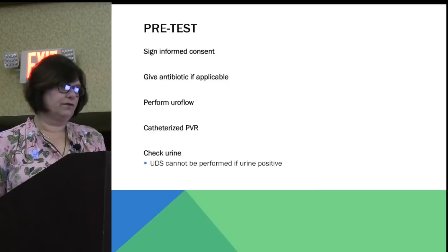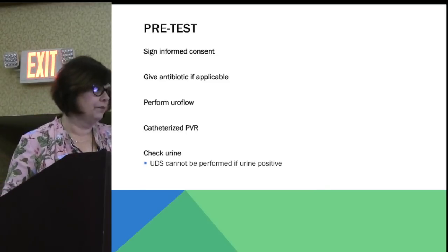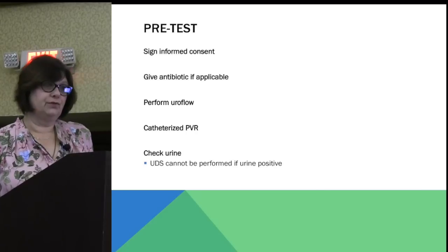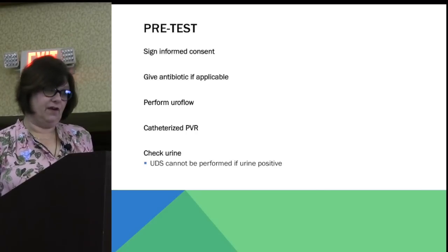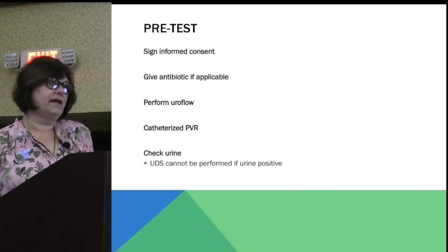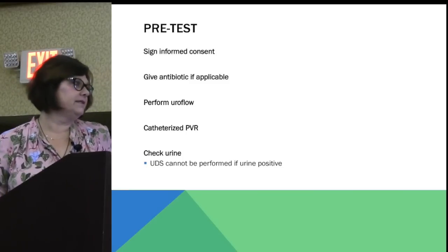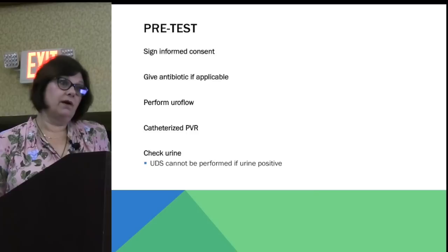They sit down on the commode with their full bladder and they do the uroflow. After the uroflow, we usually do a catheterized PVR. We want to know, did they fully empty, right? We don't know what they came in with because they came in with a full bladder. So we want to know, did they completely empty?